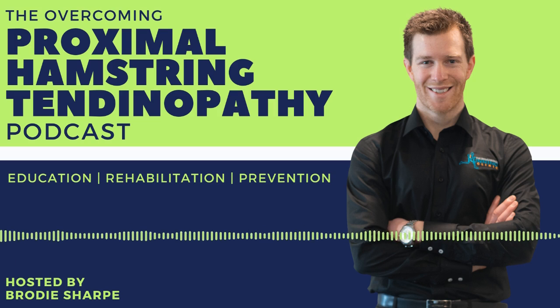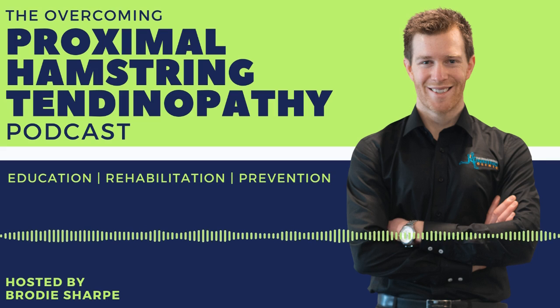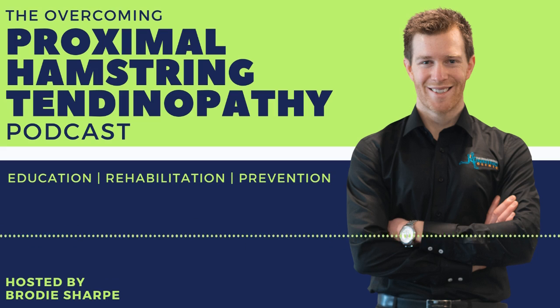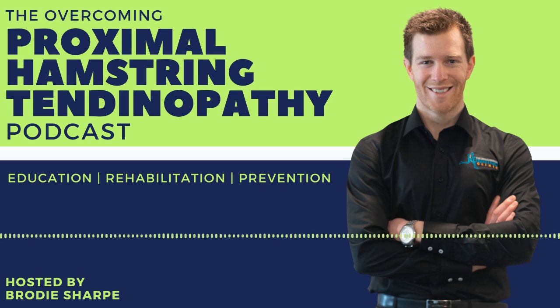The way I give an example to my patient is, it's like a course of antibiotics. If your GP has given you 7 days of antibiotics, you're not going to stop after day 3 just because you feel great. You need to complete the whole thing. With shockwave you don't make or break with 1 session. The change takes at least 3 sessions. So if you're going to have shockwave for any part of the body, the minimum dosage is 3.